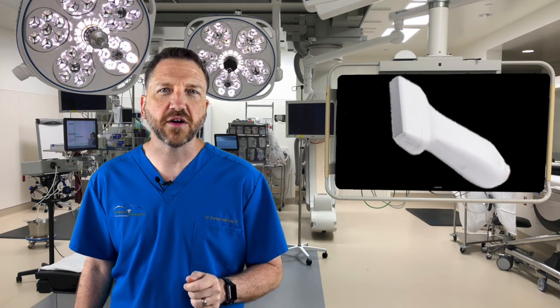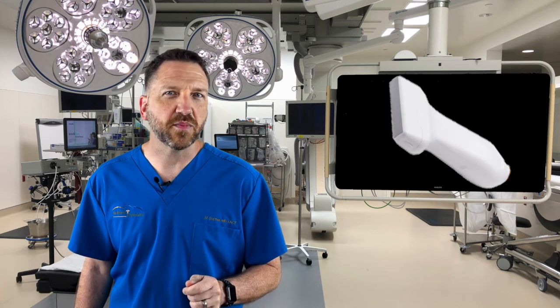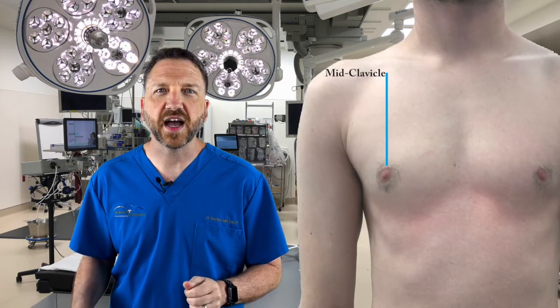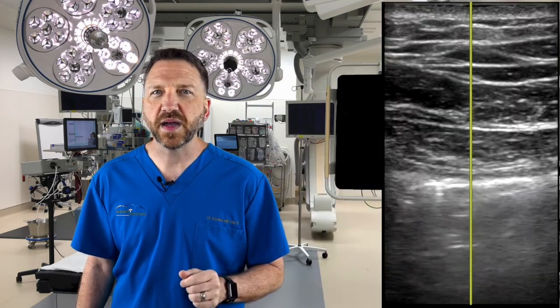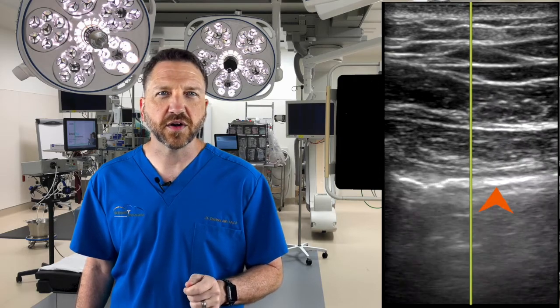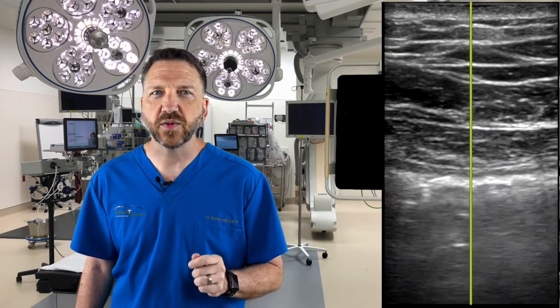The eFAST extends the exam to the chest evaluating for pneumothorax. This can be accomplished using the vascular linear array probe, placed in a vertical orientation with the marker pointed superior. Position the probe along the mid-clavicular line in the third, fourth, or fifth intercostal space maneuvering between two ribs. In B mode, there should be a bright stripe that appears to be sliding — this is the visceral lung pleura sliding against the parietal pleura. The lack of sliding is consistent with pneumothorax.